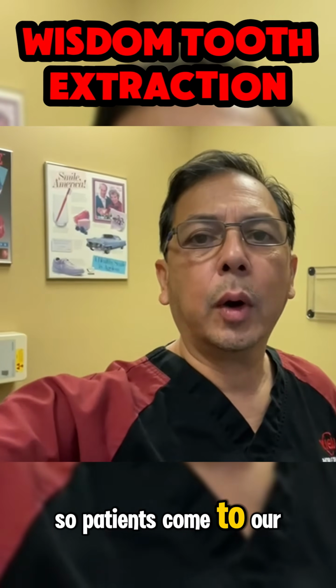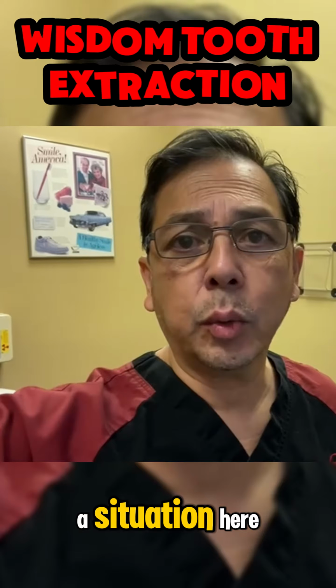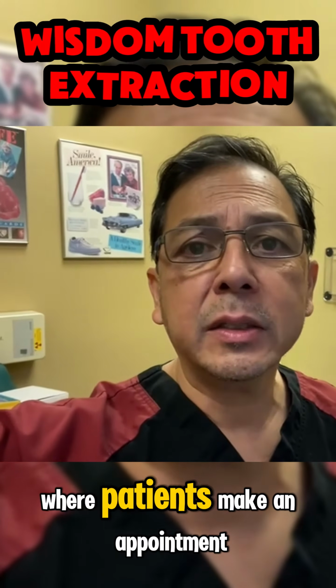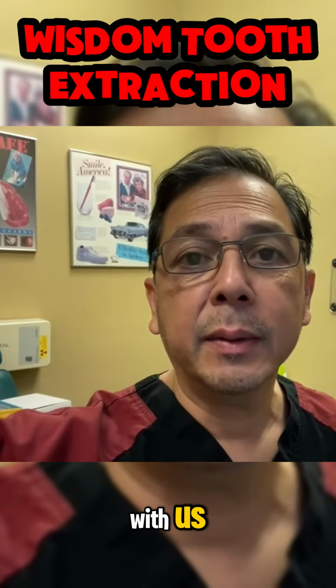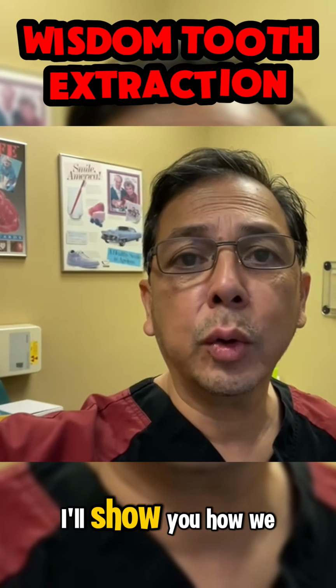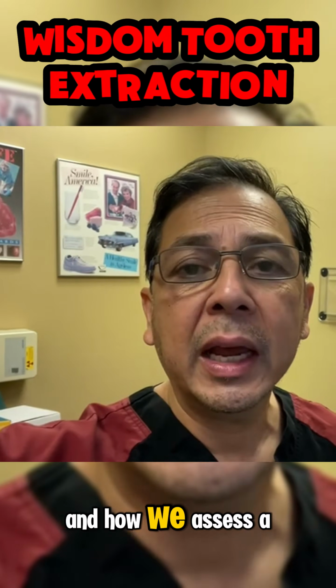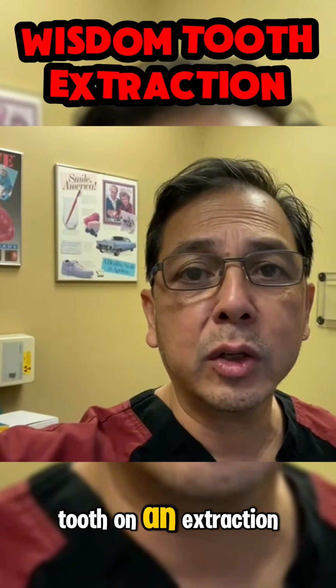So patients come to our office with tooth pain, and I'm going to show you a situation here where patients make an appointment with us because they have toothache in the third molar. I'll show you how we look at it as dentists and how we assess a tooth for an extraction.